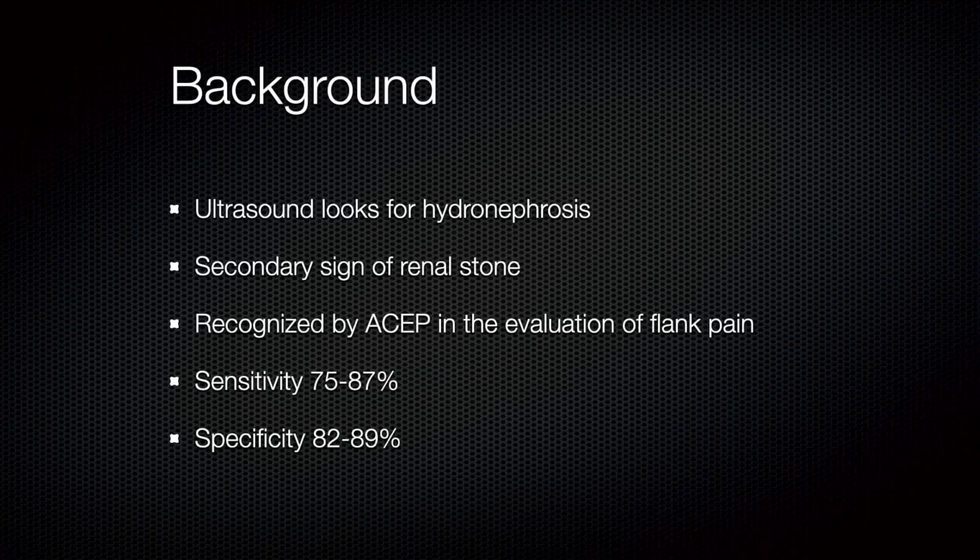This is a recognized modality by ACEP in the evaluation of flank pain, looking for hydro. And the ultrasound itself has a sensitivity of about 75 to 87% for hydro and a specificity of 82 to 89% for hydro. So from that perspective, it performs decently well to evaluate for that specific end. But the question is, can we apply that to stones, right?